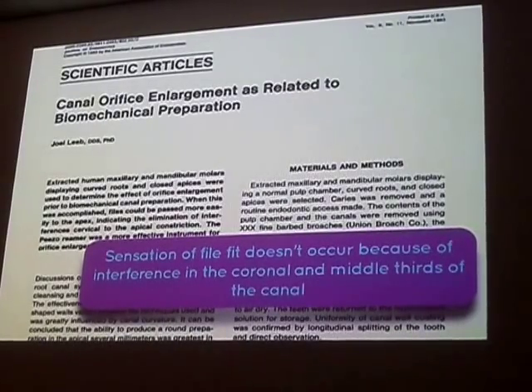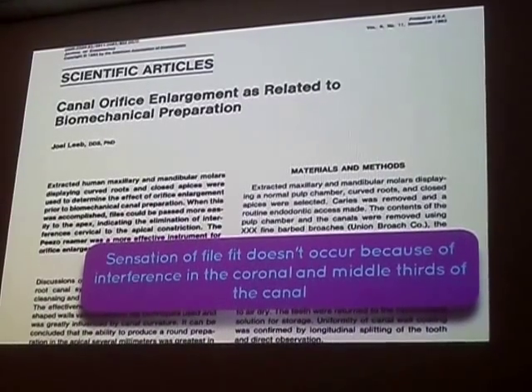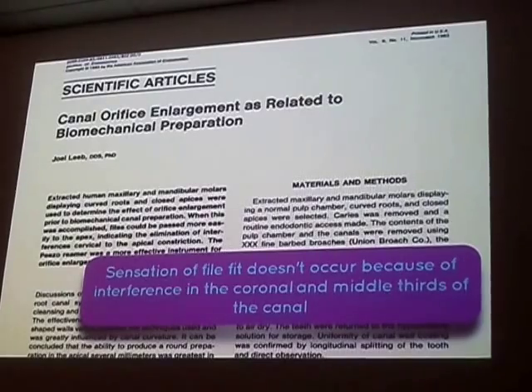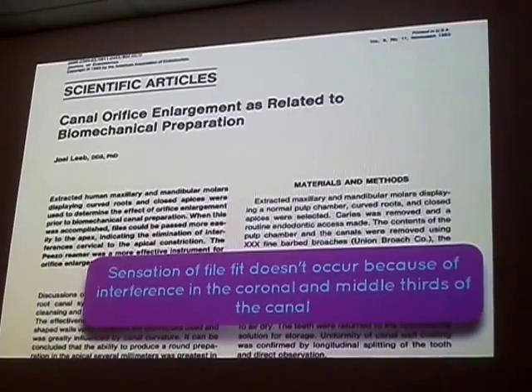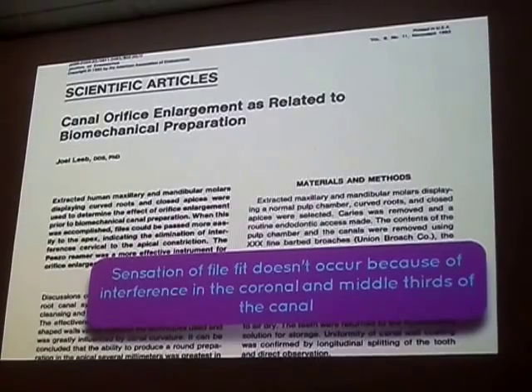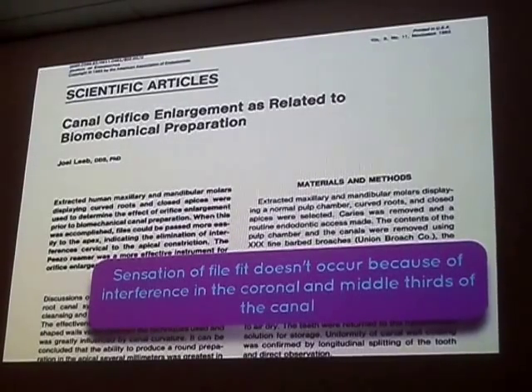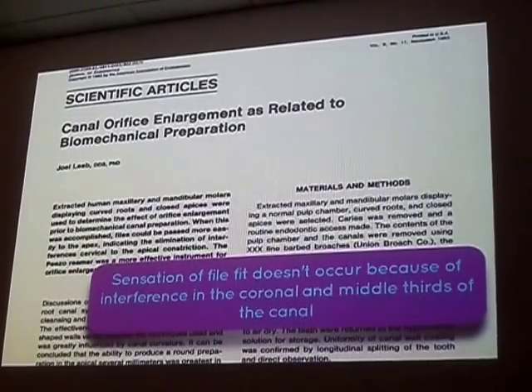Lo importante aquí entonces es para nosotros poder determinar cuál es la primera lima que va a ajustar o que va a hacer el ajuste apical a nivel apical. Es importante que nosotros tengamos una buena preparación previa de la entrada del conducto, el acceso y la preparación de la entrada y del primer tercio del canal, ¿no? Para que nuestros instrumentos puedan ingresar de manera adecuada y nosotros táctilmente podamos tener esa sensación de cuál es ese primer instrumento que va a empezar a trabajar.